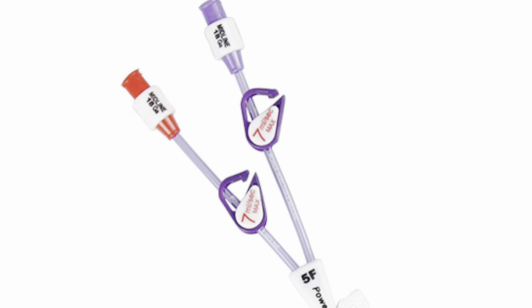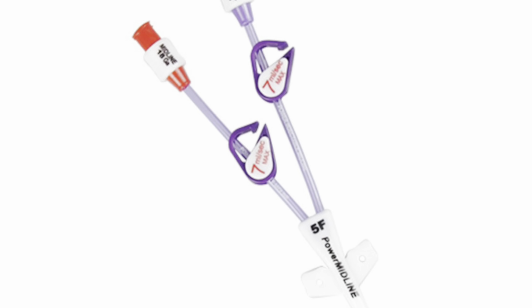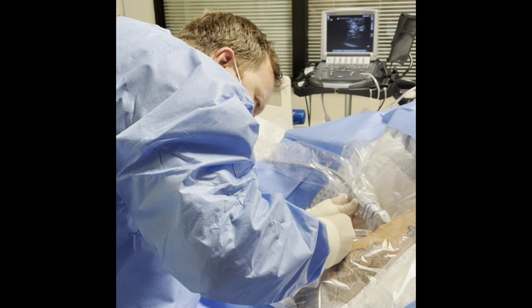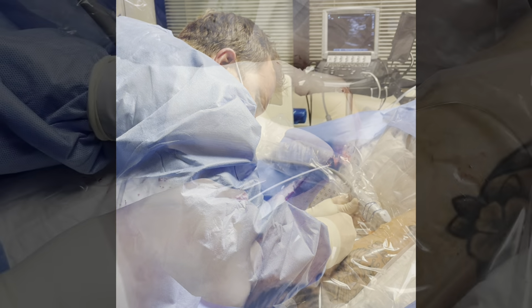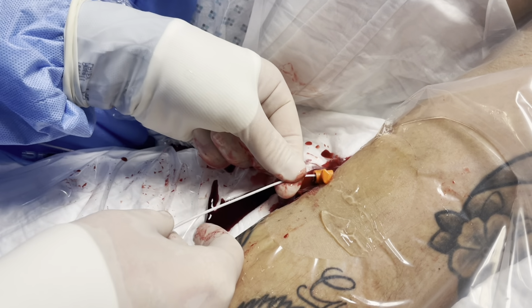A midline is an intravenous catheter inserted into the upper arm with the tip located just below the axilla. These devices are placed using an aseptic technique in the upper arm. The tip of the device does not reach the central venous vasculature.